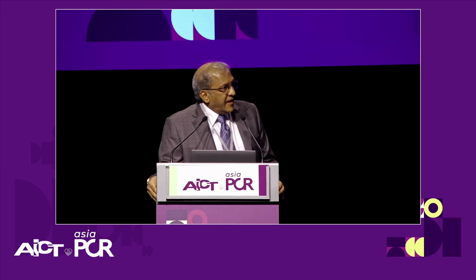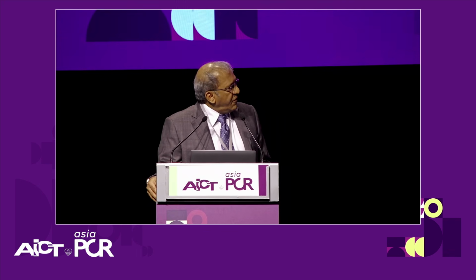Unless something really dramatic comes up with the next balloon, I think that ablative exercise on that calcium does improve crossability for bulkier devices, particularly if you've already used IVL in another artery. If you have to take a second artery, it might make it a little easier to negotiate.